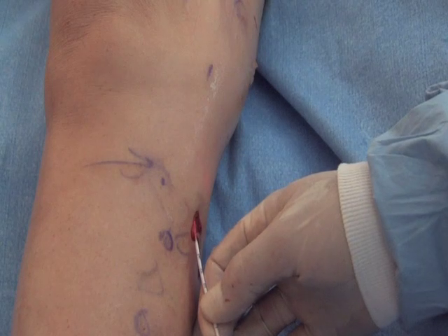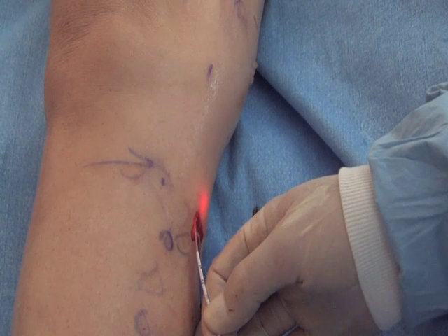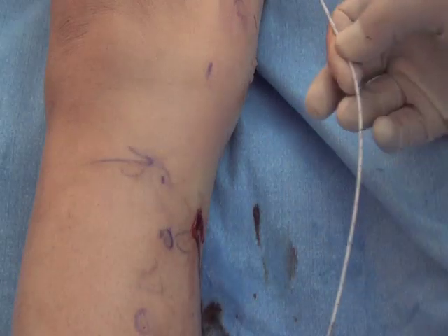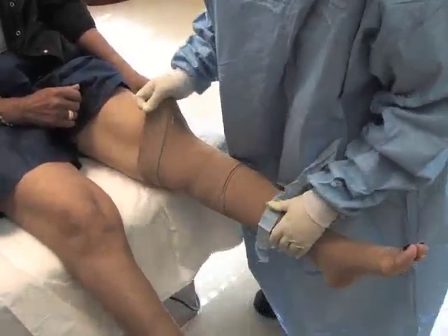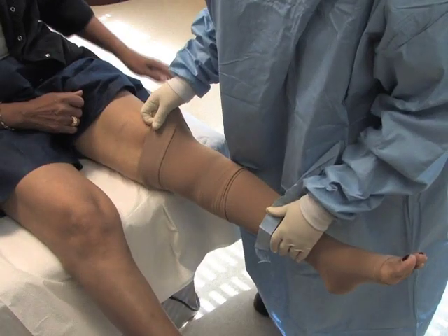Generally, laser ablation time totals 90 to 120 seconds. After removing the laser fiber and introducer sheath, clean the insertion site and apply a compression dressing.